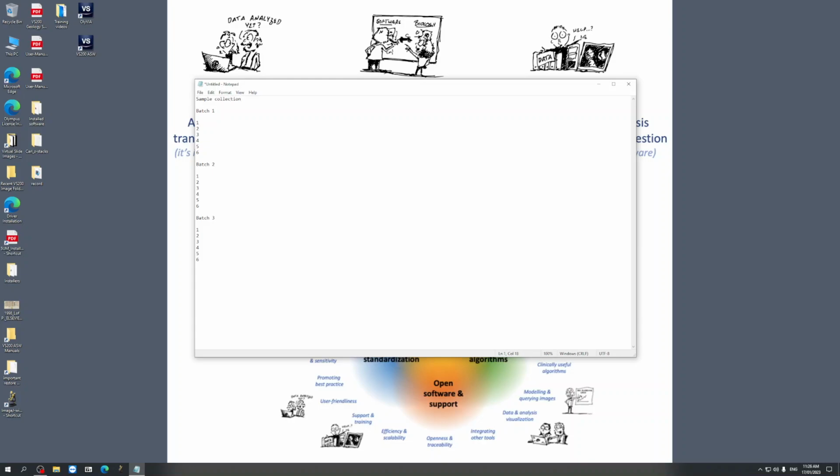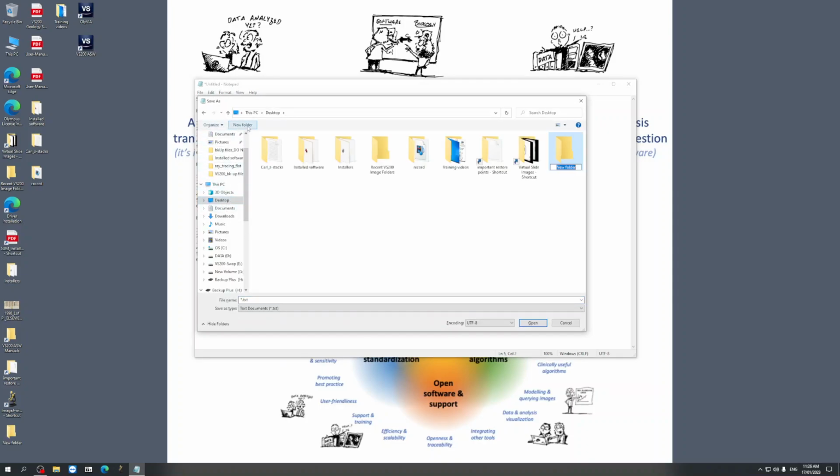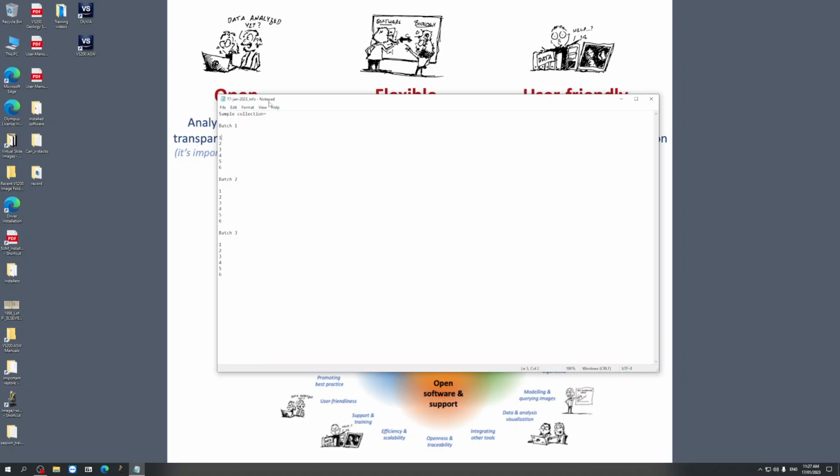So put all of that information into this notepad and save it into an easily accessible folder on the desktop, for example, session training, where you're going to save this file as the date. For this session, we only have one sample. The name is TSJ2KB and it is set up in Pocket 3.